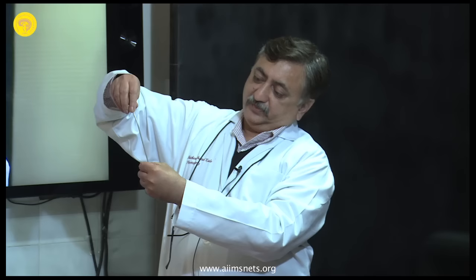So let's start with the most difficult scenario, where you can't see anything. The best thing is to dissect this joint. See the spinous process, follow the lamina. Follow the lamina right up to the facet, what you see as a facet. This is the facet. Similarly, follow the lower lamina. Clear all this away, see the facet. If you distract a little bit, that's the joint between the two facets.